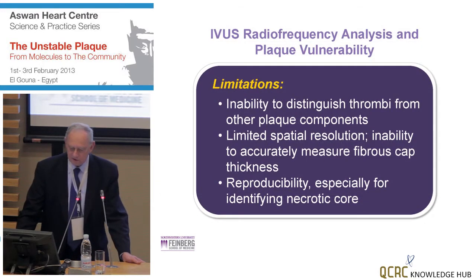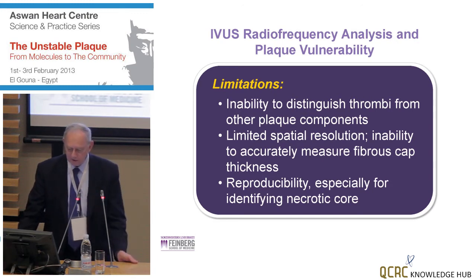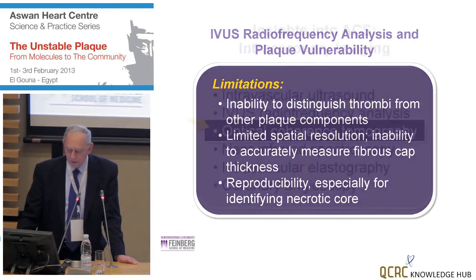Limitations of this analysis are the inability to distinguish thrombi from other plaque components, limited spatial resolution because it is ultrasound, and again, therefore, the inability to accurately measure the fibrous cap, and then the reproducibility of these tissue measurements really, I think, needs further validation.